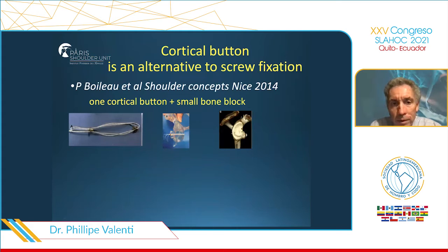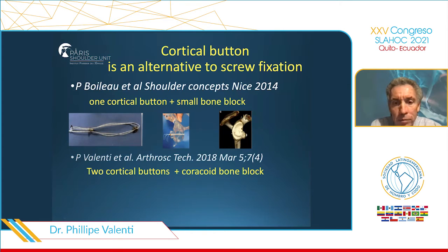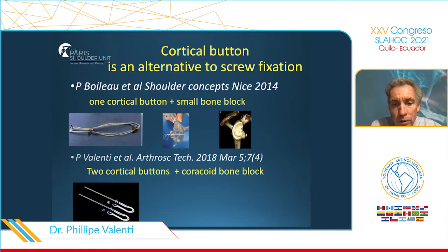It's the reason why Pascal Boileau was the first to report 1 cortical button with a small bone block in 2014. And I reported the same technique, but with 2 cortical buttons on a big coracoid bone block. And I use the same technique as Latarjet, but by arthroscopy with 2 endo-buttons.